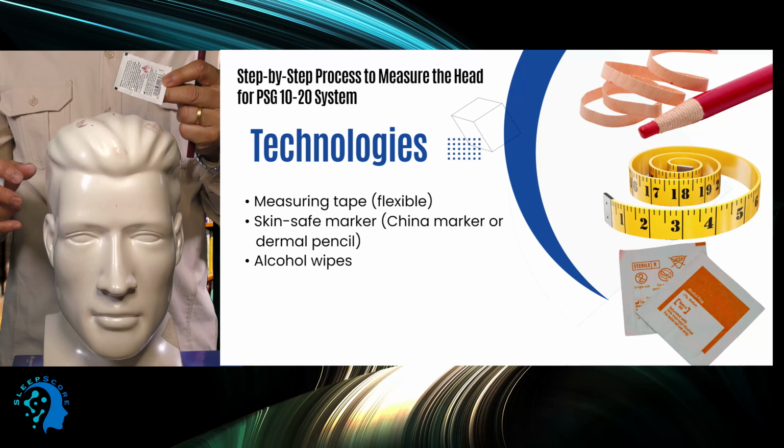Now the second thing I do, I take 10% from this region up. Because it was 38 and I'm going to take 10% of this, which is 3.8, I mark like this. See? I mark like this. This is the 10%. So this mark is 10% of this. And I have marked here the half of this one.